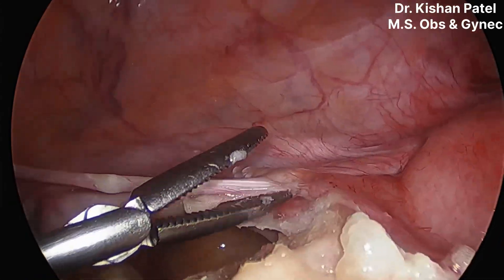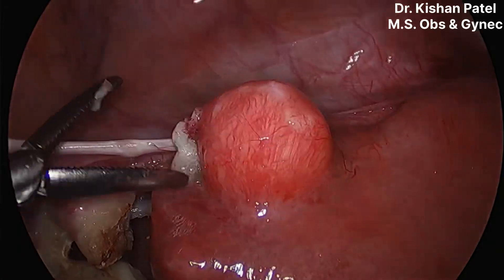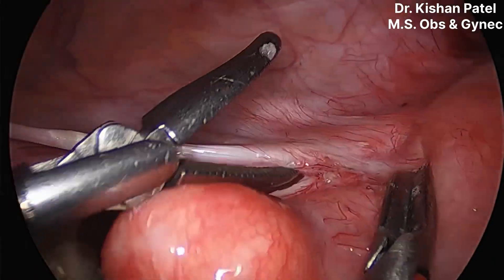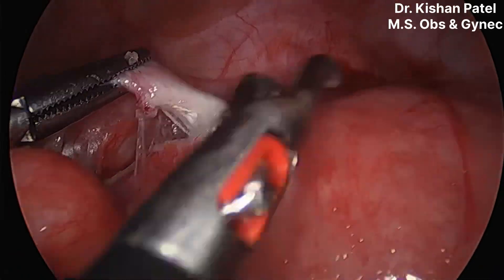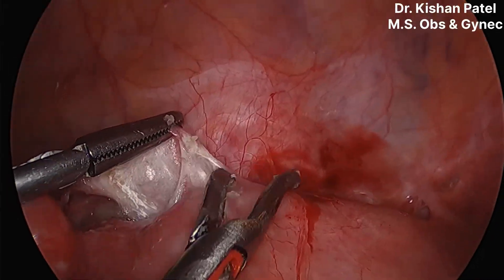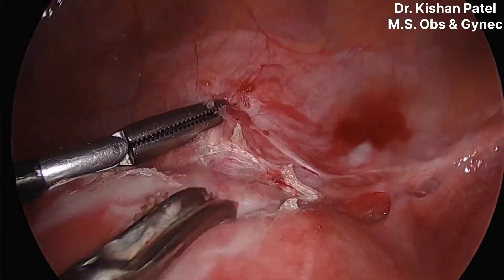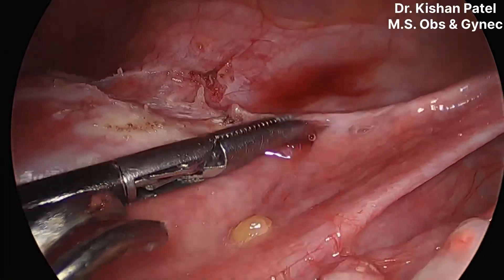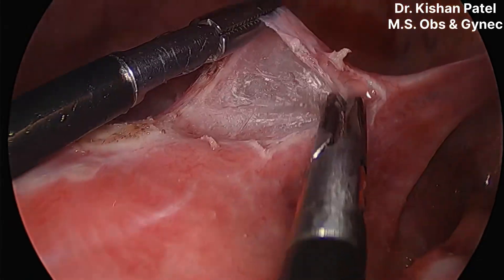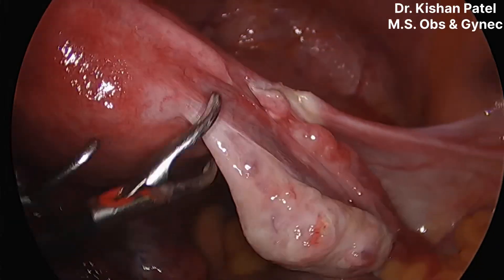I am having difficulty due to a small fibroid making instrumentation problems - you can see that small fibroid coming in the way. I am holding that fibroid and cutting the peritoneum over the uterus only. We should keep in mind that we should not go directly for central dissection in a case of previous one or two CS. As this case is of previous two CS, we will gently separate the peritoneum over the uterus using lateral window technique very slowly, because we might not know if we are cutting peritoneum or bladder - we can end up with bladder injury in these types of cases.